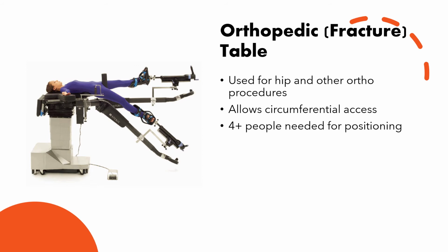All right, the patient, when they're moved on to the table, it does not look like the image that you see here. There's no post, that's called the perineal post. Let me circle it for you. This that you can see right here is called the perineal post. That is not there. And there is actually a bottom to the bed that extends out like this. All right, all of this stuff is kind of just pushed down into the side. So the patient gets moved over, the patient gets put to sleep, their feet get put into these boots that you see, then the perineal post gets inserted.